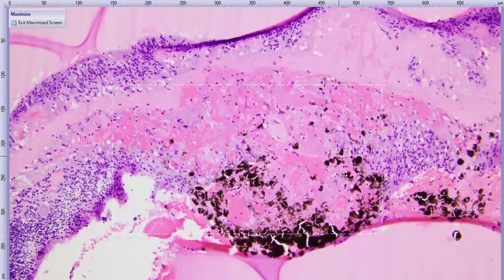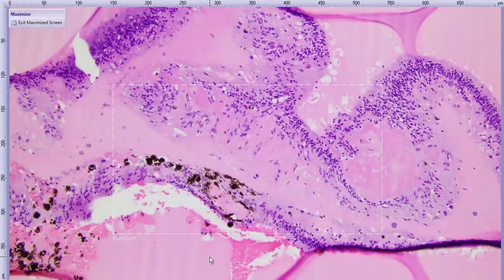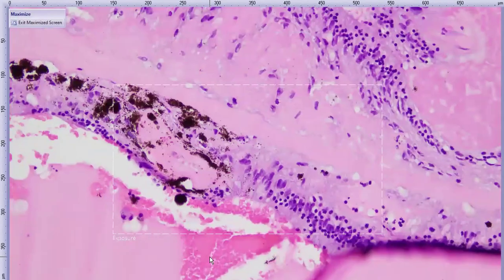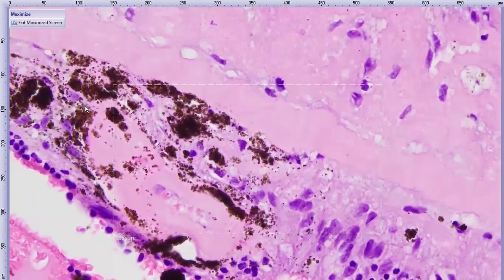There's some pigmented RPE cells that kind of detach together. So there's a focal area of a retinal hemorrhage and necrosis. So not only do we have retinal detachment and atrophy, but we do have active necrosis. If you look here and there, you find some retinal vessels that are very interesting looking, like this fella right here. Bunch of RPE cells around.